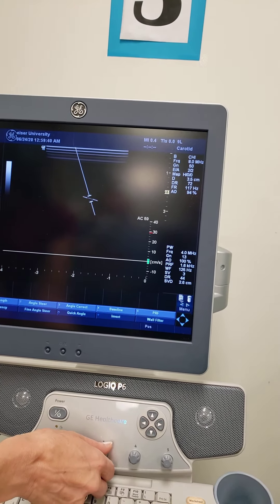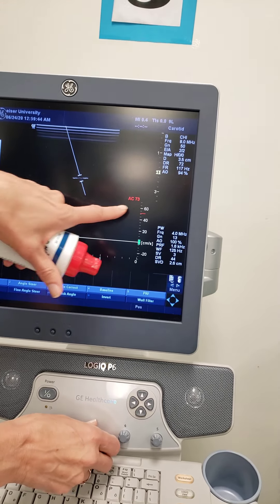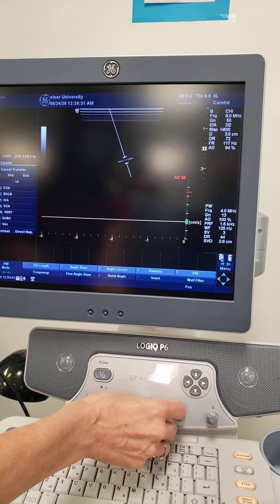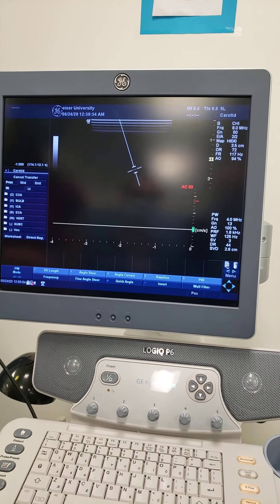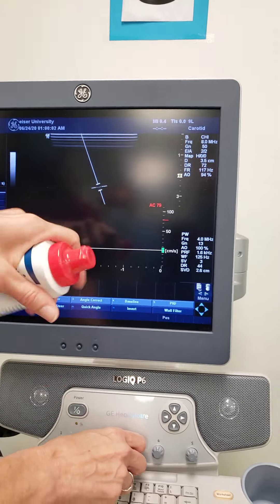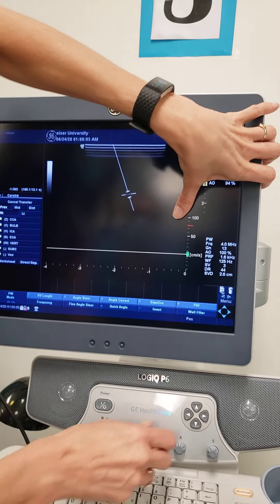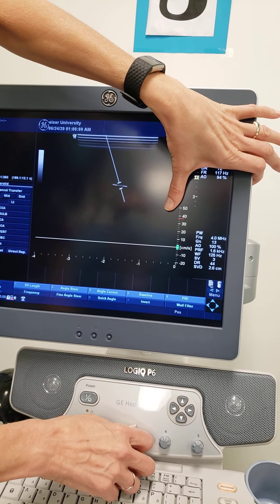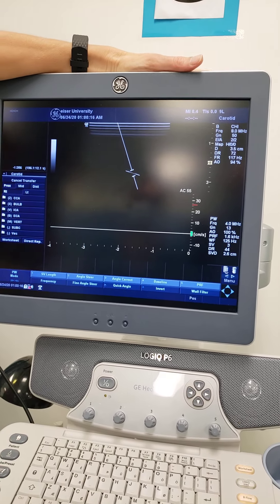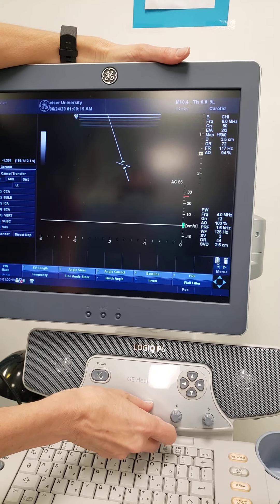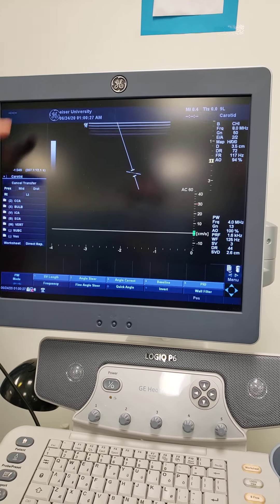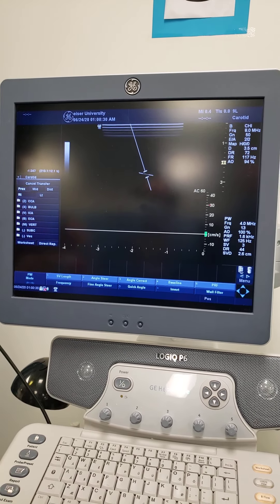No, you want to put it in the middle where the flow actually is. It automatically goes red on this machine — not all of them will — to show you that you probably don't want to use that angle. This one is so close to 90 degrees. You practically have 90 degrees there. But 60 is harder to see, right? So let's say we weren't looking at this guide — tell me when you think we're at 60. Around that? I would say there. Let's see. What does it say? 55.